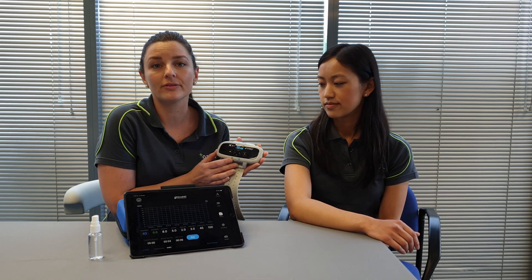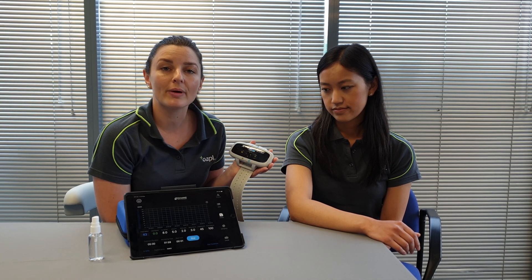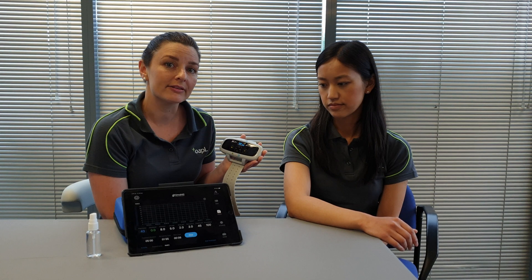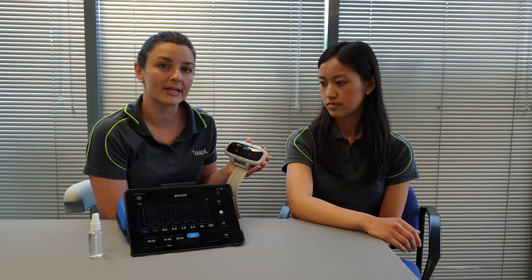The device sits on the upper arm or the forearm. The further away from the wrist that you use it, it will provide more wrist extension, and the closer to the wrist that you locate it, it will provide more finger extension — and we're going to show you that in just a moment.